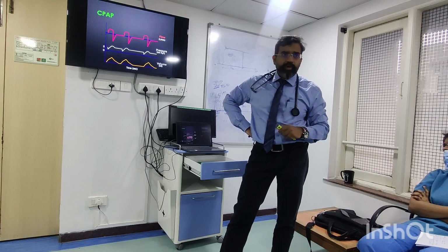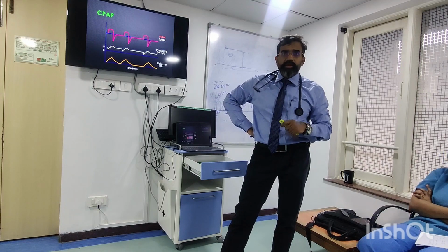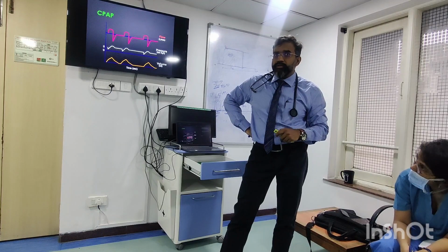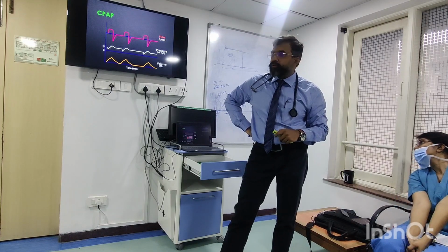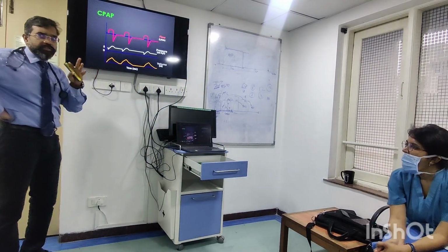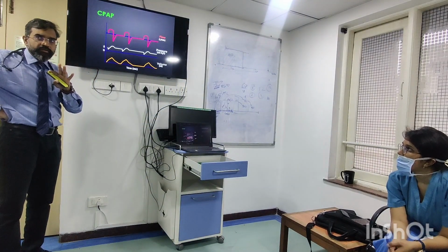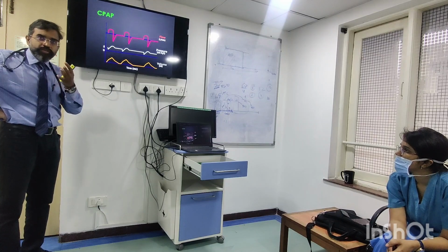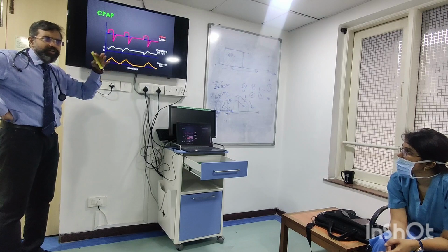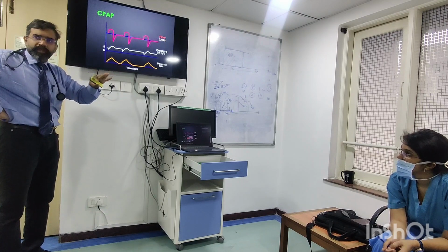And this is what is CPAP. Now tell me about CPAP. Mega, can you tell me about CPAP? What's happening here? What is the trigger? Patient triggered, yes. Because there is no trigger. Is there a trigger here? Is the ventilator delivering any support here? It's not delivering a breath. So you don't talk about trigger.